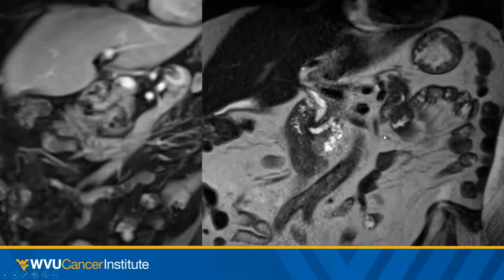Here we have a classic example of a side branch IPMN. Most commonly, these are described to be and found in the uncinate process, although we can find them elsewhere in the pancreas. But on the right-hand image, we have a thin section T2 weighted image, which shows that there's this multiseptated cystic mass in the uncinate, and we can see it communicating clearly there with the main duct in the pancreatic head. And the left-sided image is a post-contrast image where we can even see there's a little bit of enhancement in some of these internal septations.